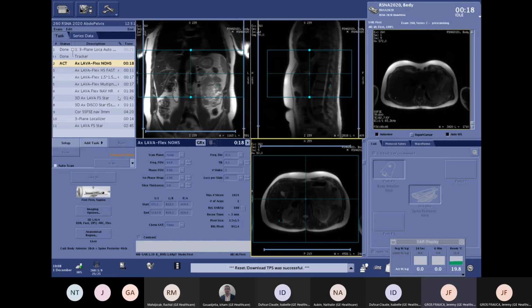And here you will tell me maybe 18 seconds. It will probably be nice image quality, but it will be too much for my patients. I don't have a lot of patients who can accept and perform 18 seconds of breath hold. And more, you have to repeat those breath holds several times during the examination. It will be complicated for them.